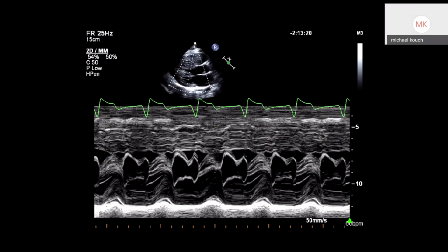All right, so these are going to be relatively difficult if you've never looked at M mode before, but we're going to work through them. So there's something that's different in this picture from normal. Can anybody in the room see something that's different here?